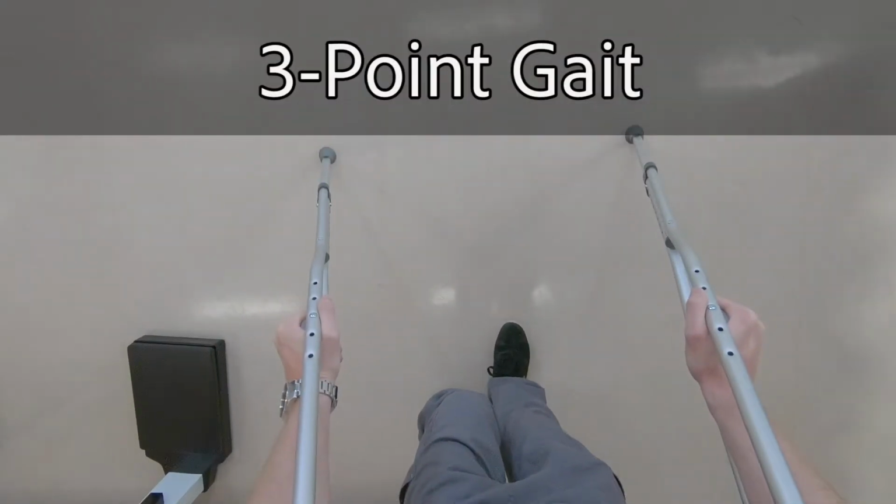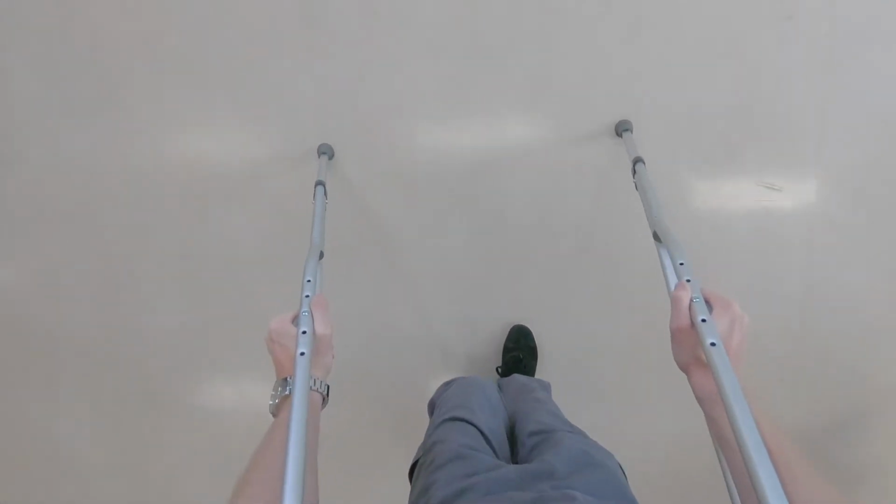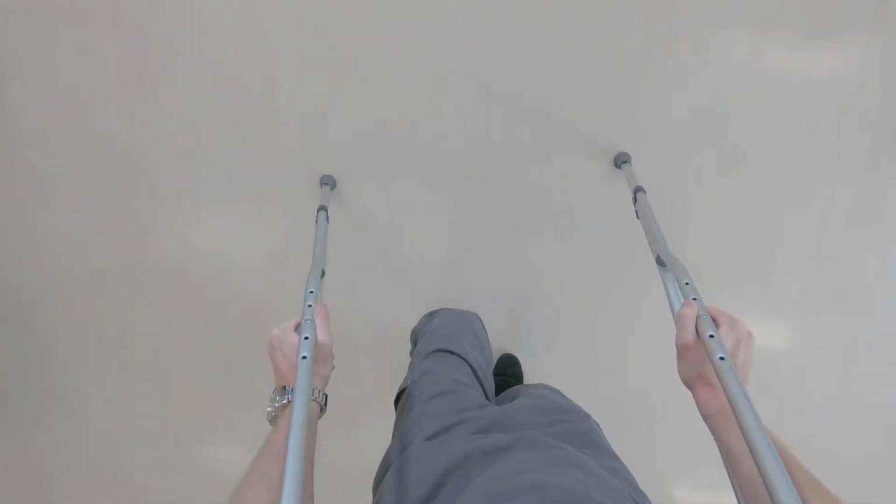For a 3-point gait, advance both crutch tips forward, then hop with the non-injured leg to the crutches. This is also called the swing to gait, as you're swinging to the crutches and not past them.